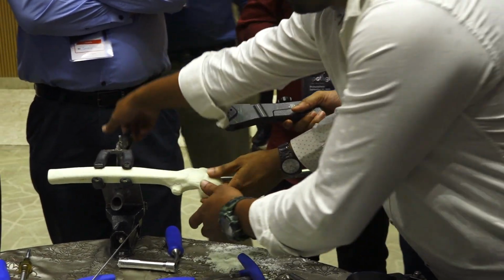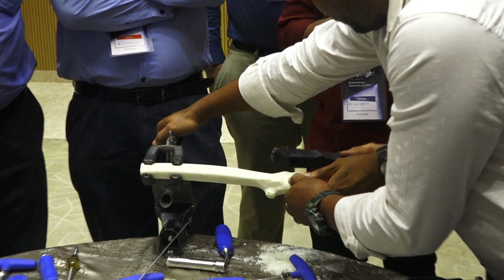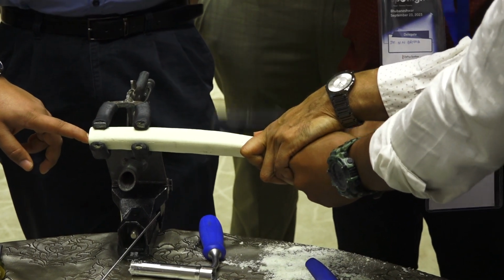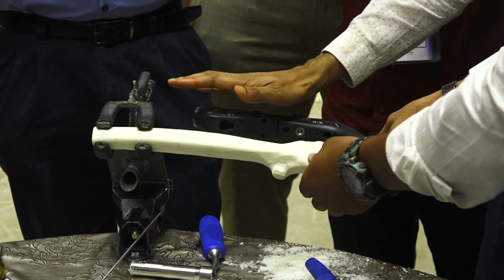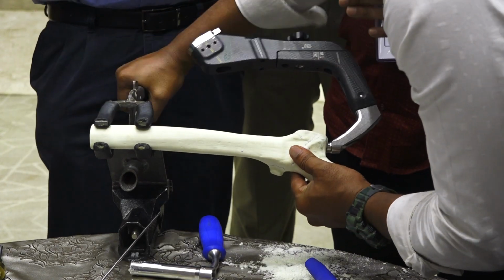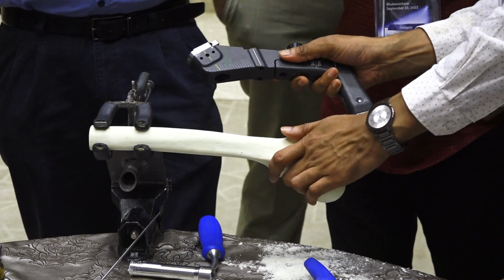Initially in a short nail it is not a big issue. You can directly put the nail. In a short nail you can push the nail like this, but in a longer nail you have to keep the handle a little anterior initially. After negotiating the curve you turn it laterally, so that will be easier.